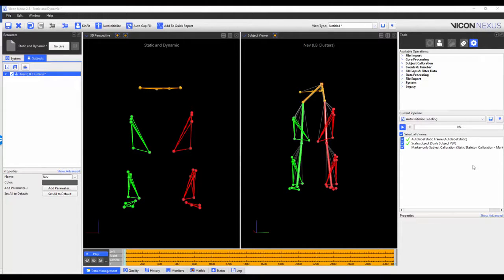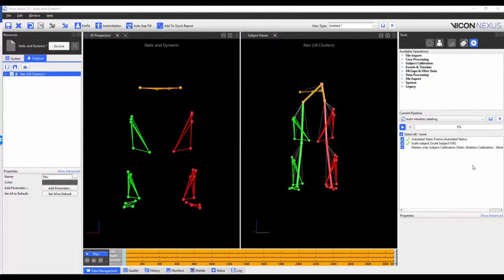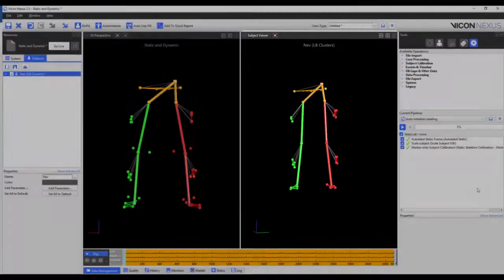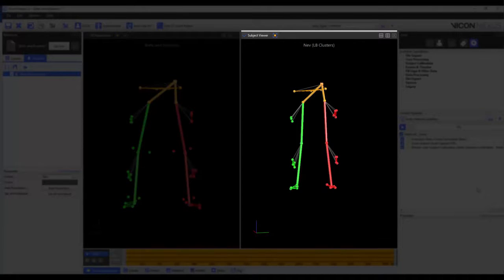The final step in the pipeline is to use the markers-only subject calibration pipeline operation. We are using the markers-only subject calibration because the joint locations in the model were already optimized when we built the VST, and so all we need to do is to reposition the markers in the VSK. After the operation has been run, we can see that the markers have been repositioned in the subject viewer, but that the segments and joints have stayed in the same position.